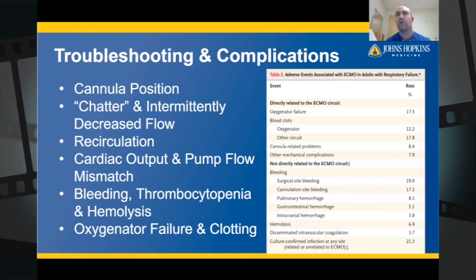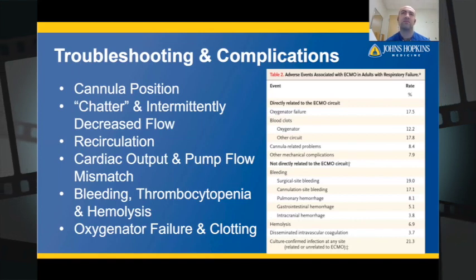Therefore, we monitor LDH and platelet counts. And then as flow increases, shearing forces damage blood cells. If possible, the first mitigating step is to reduce pump speed.